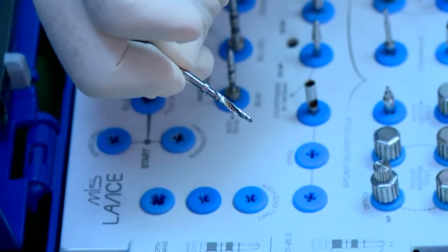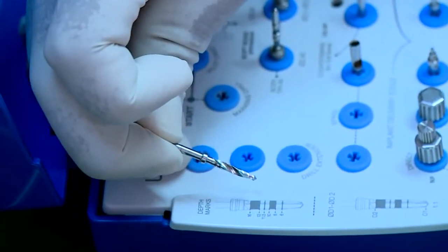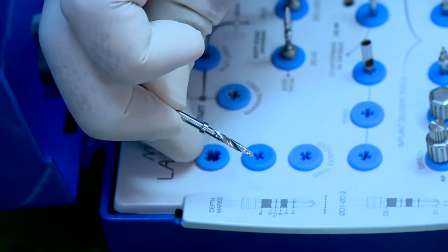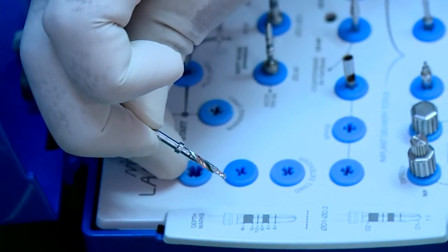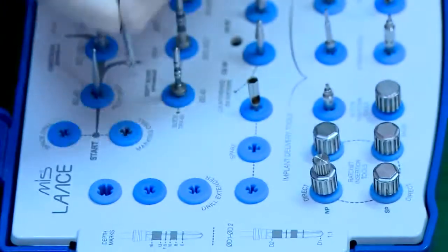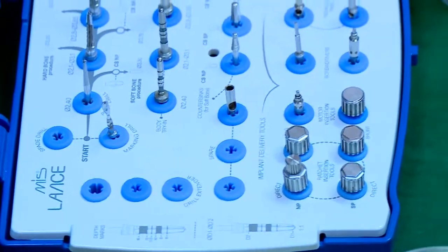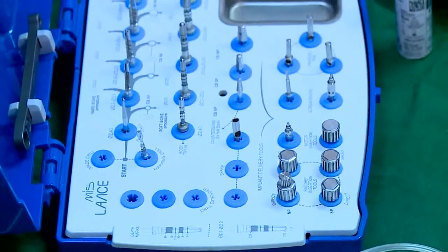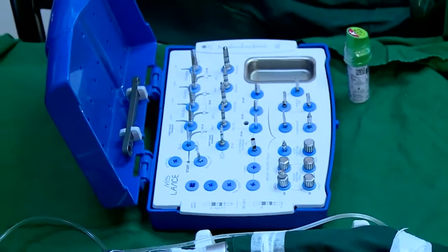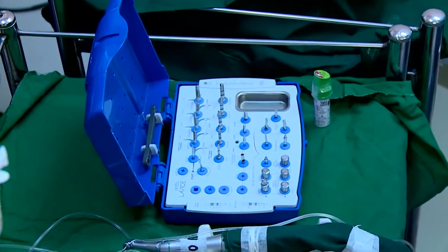So we talk about the various depths. We have implants which start at 8 millimeters, 10 millimeters, 11.5, 13, 16. These are the so-called standard stock implants which are available in most systems. So we go for sequential drilling, which means if you are going to place an implant as wide as 5 millimeters, you don't start with the 4.2 drill. You start again with the pilot drill, then go sequentially: 2, 2.3, 2.7, 3.2, 3.7 and come to 4.2.